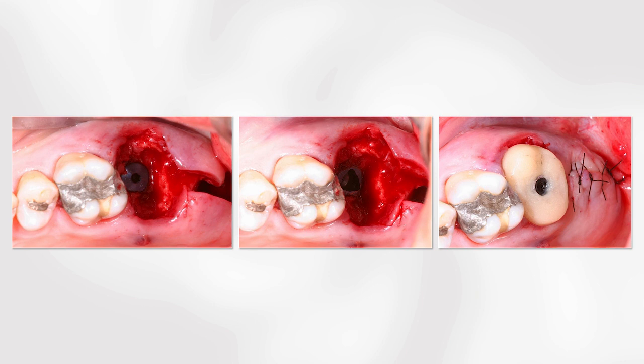This is a kind of case in which we expect very low morbidity: no swelling, no pain, nothing. But one of the criteria that we have to pay attention to here is the implant stability. The implant stability should be equal to or more than 30 Newton centimeters. Of course, higher primary stability would be preferable, especially in the posterior zone. That's why we have to do the site preparation using all your skills and the technology available in the market.